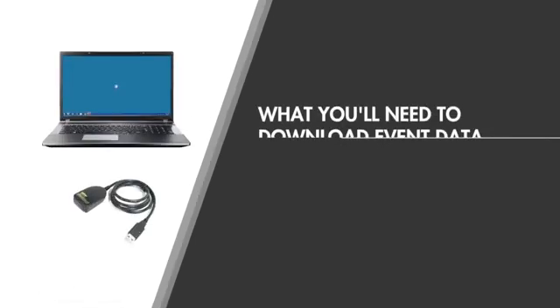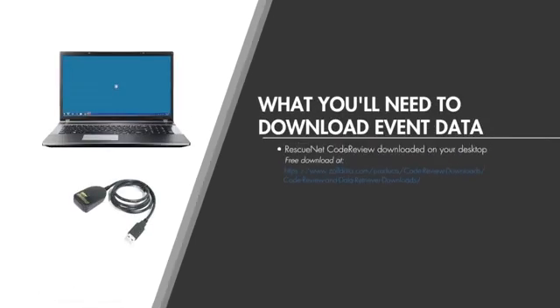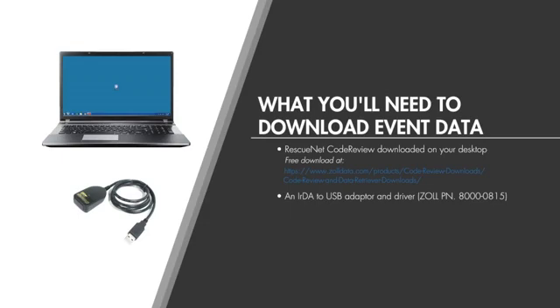Communication with the AED Plus is facilitated through the IRDA or infrared port on the AED Plus and your computer's USB port. Prior to downloading data from your AED Plus, you will need to download RescueNet Code Review to your desktop.